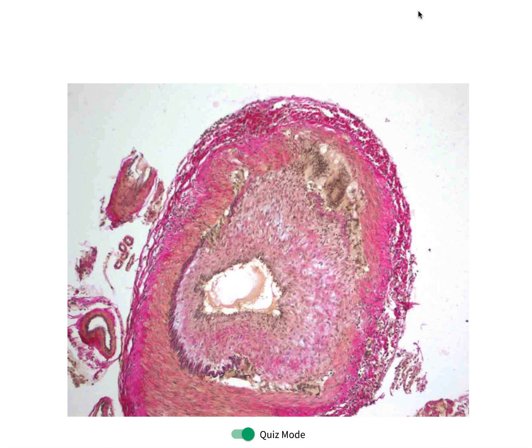We're not limited strictly to identifying structures, but also the associated features that help real radiologists and pathologists both localize and characterize pathologic findings. In this stain of giant cell arteritis, when you mouse over the brown patch, not only does it identify it as a granuloma, it also causes the giant cell to pop out in red, which is a key feature to characterize this as granulomatous inflammation.